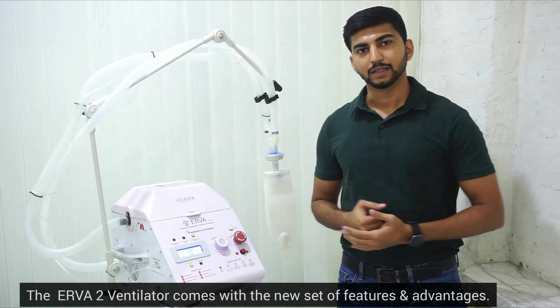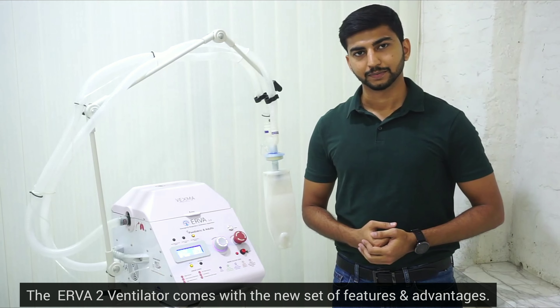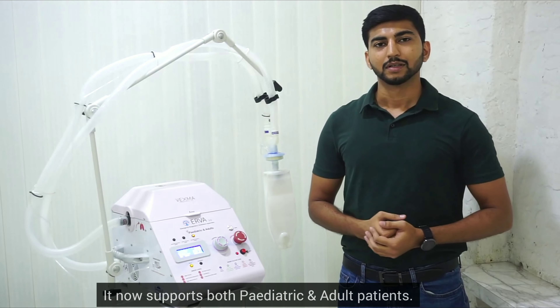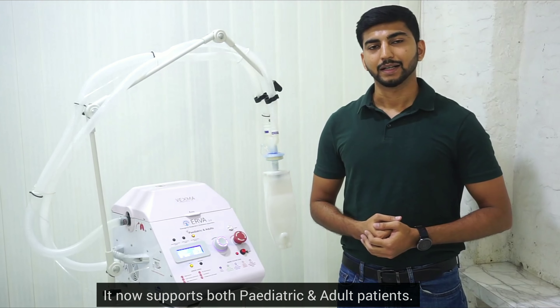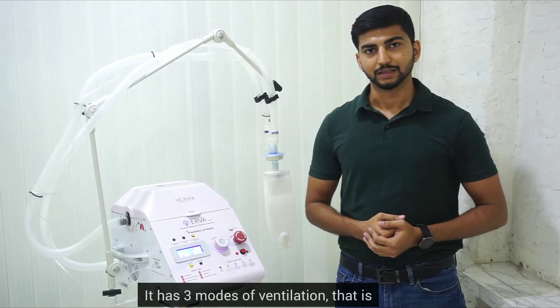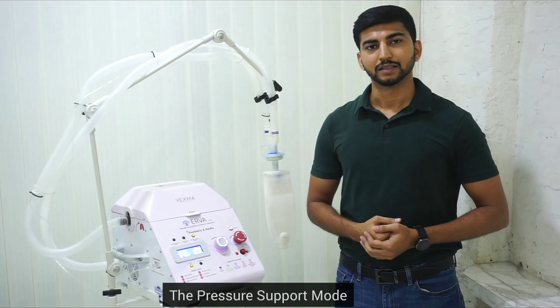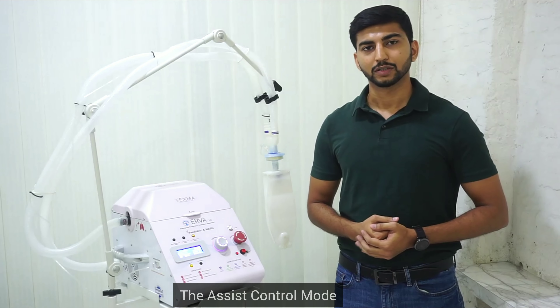The ERVA 2 Ventilator comes with a new set of features and advantages. It now supports both pediatric and adult patients. It has three modes of ventilation: the pressure support mode, the assist control mode, and the volume control mode.